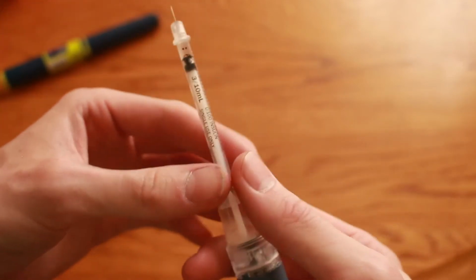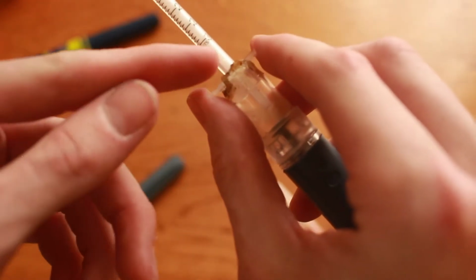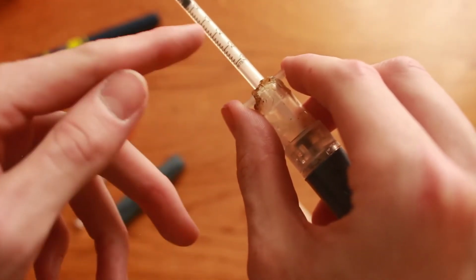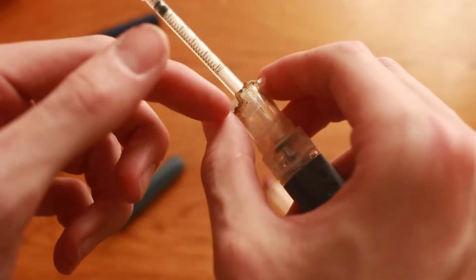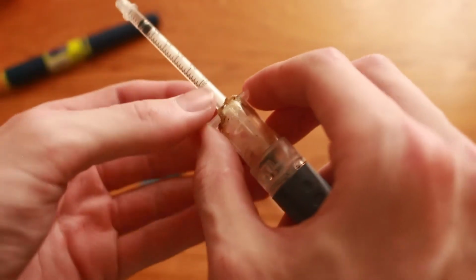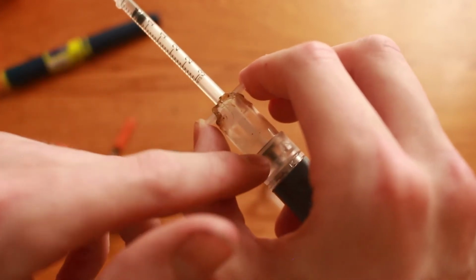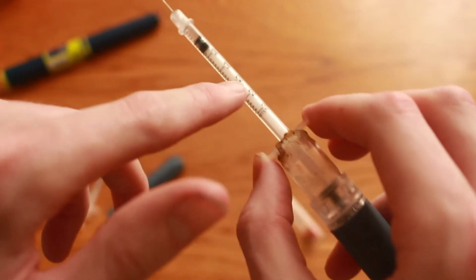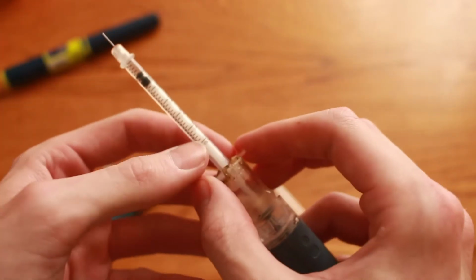Okay, so this is what it looks like. Again, I basically just cut off half of the clear part, and I burned through it a little bit so that the wings here could fit. But the idea is the plunger's in there, that plunger pushes that one, which ends up pushing it here, giving you that precise dose of insulin I was talking about.